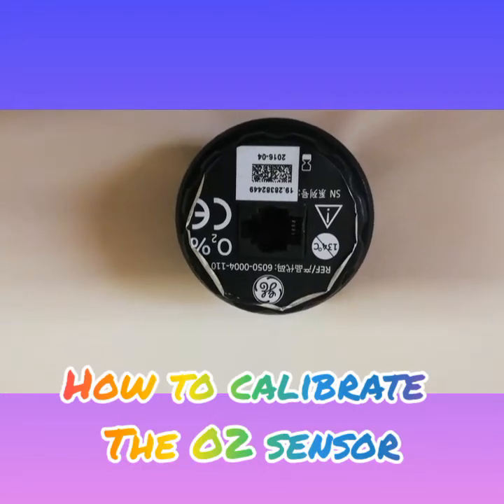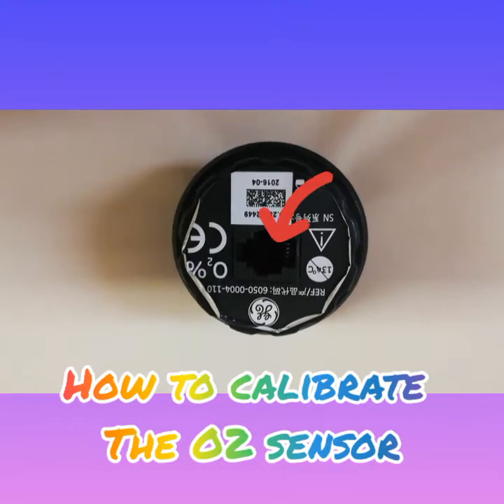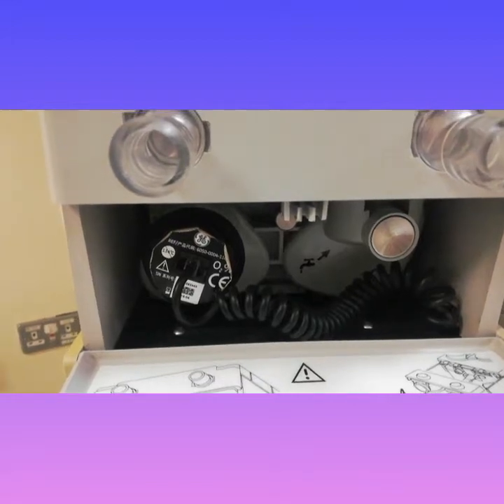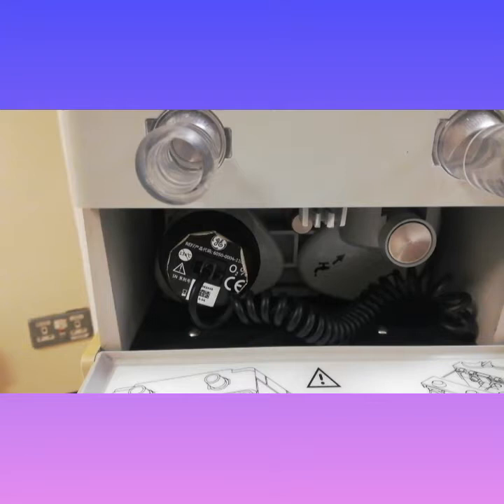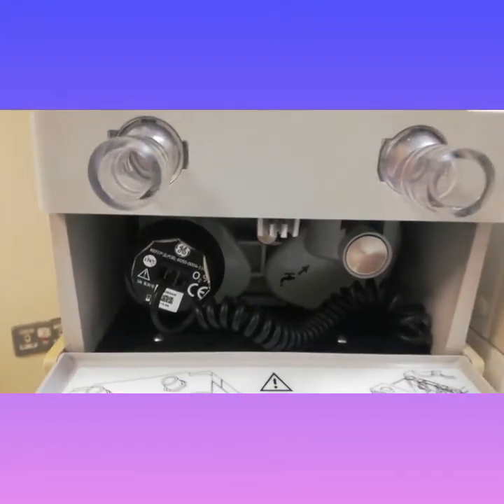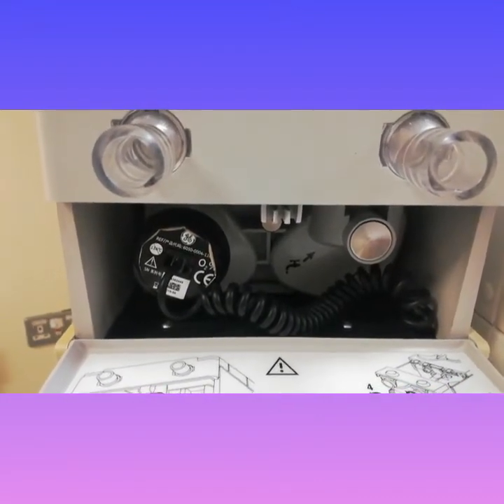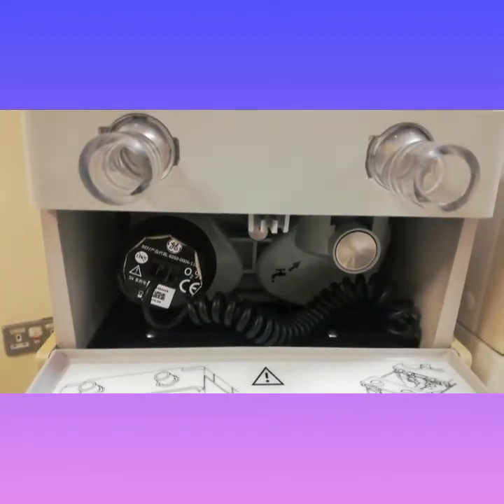This is how an oxygen sensor looks like, and this is where you connect the telephone-style cable to the oxygen sensor. The O2 cell is located where the flow sensors are on the circuit module. The O2 sensor present in an anesthesia ventilator is a very important safety device to detect hypoxic delivery of gases.